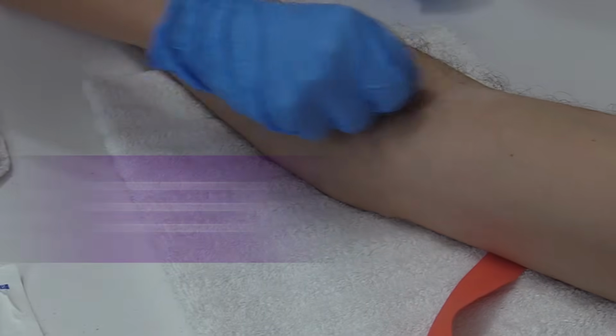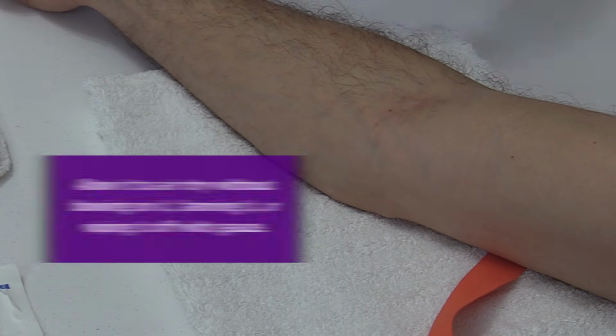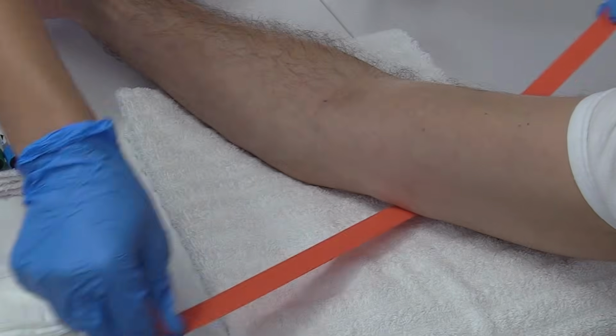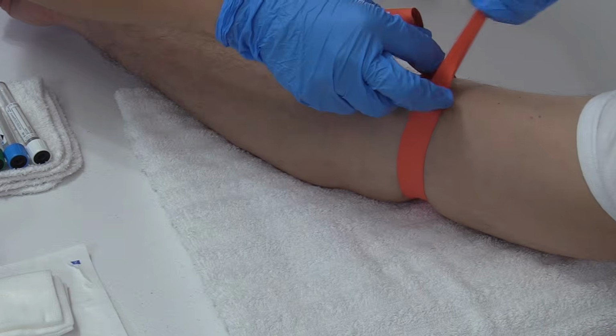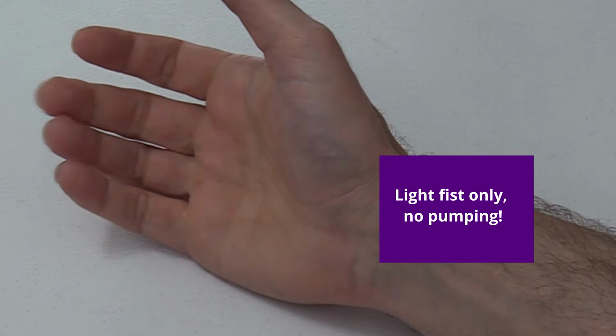And once I have done that, I'm going to let it completely dry on its own. I don't want to take a clean gauze and try to accelerate the drying speed or blow on it or wave on it. Now we're ready for the venipuncture. So I've reapplied the tourniquet, and you don't want to touch the site since we have it clean. And can you make a fist for me?